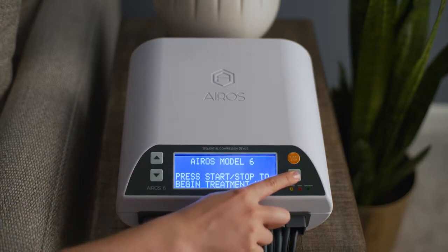To set the pressure, cycle time, and other operating parameters, press and hold the Select button for 5 seconds.